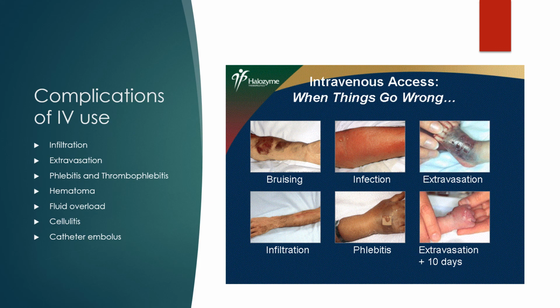The next one on the list is cellulitis. Cellulitis appears as redness, warmth, edema, streaking in that area. We're probably looking at some potential infection. So again, if we notice these symptoms, we need to discontinue the infusion, remove the IV. Again, warm compress, just similar to phlebitis. We might need to get a culture of it, see if they need antibiotics, but that's kind of our cellulitis.